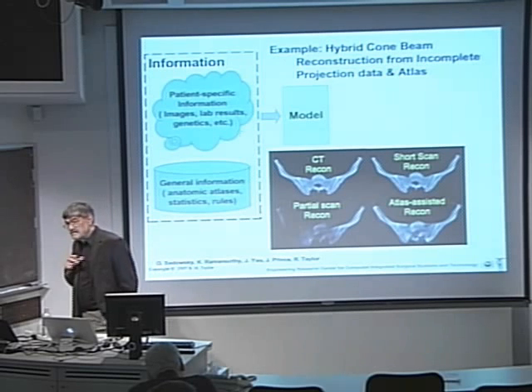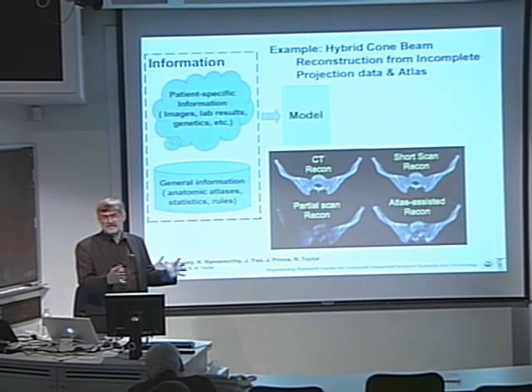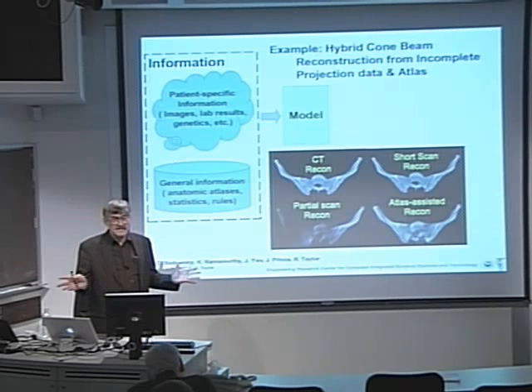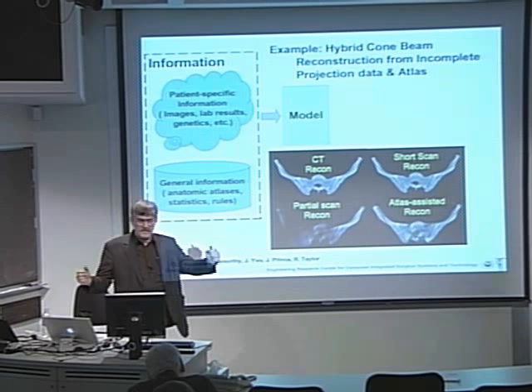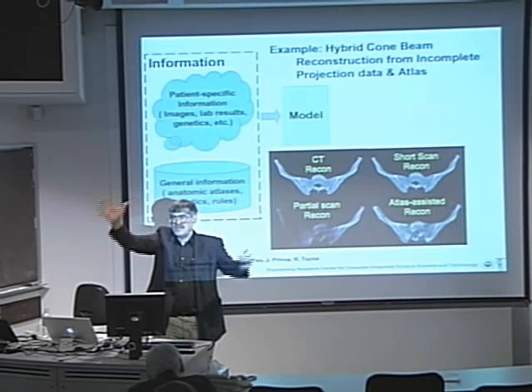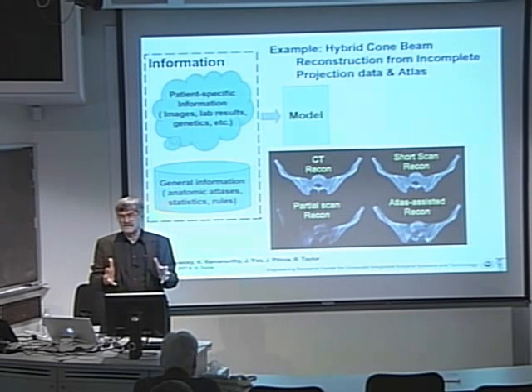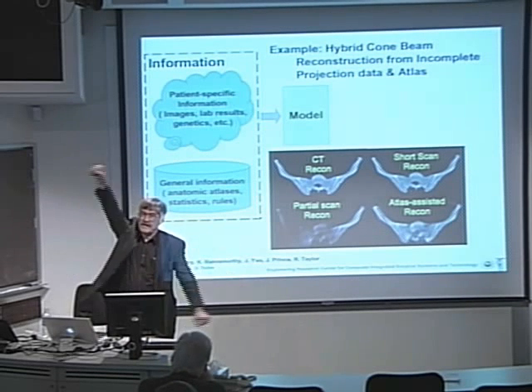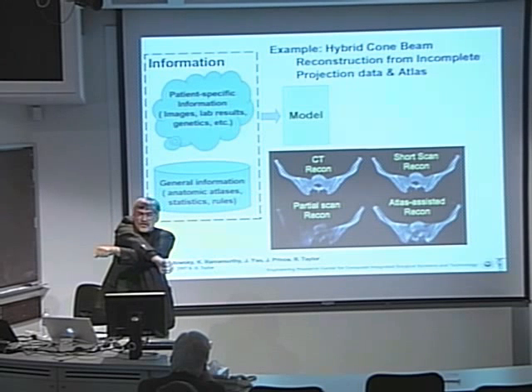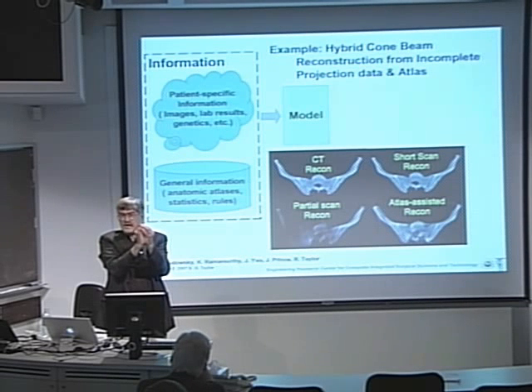Another thing that you'd like to do in an operating room sometimes is make a CT-like reconstruction on the spot. But you don't usually have a CT scanner in an OR. So you can do what are called cone beam reconstructions from a fluoroscopic X-ray machine. Now, there are practical difficulties in using this in a real OR. You can't always swing the X-ray machine through the full sweep of angles that you need to do this kind of reconstruction. And also, the field of view of a portable C-arm is fairly limited.